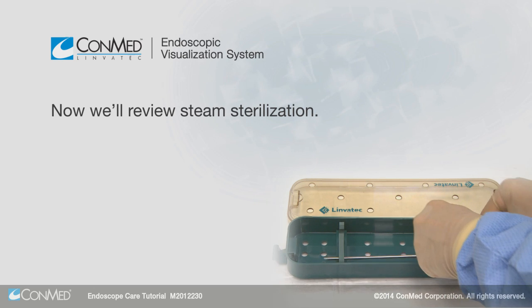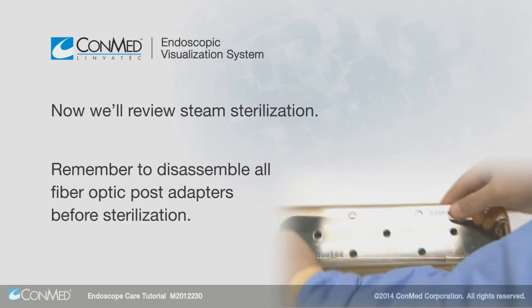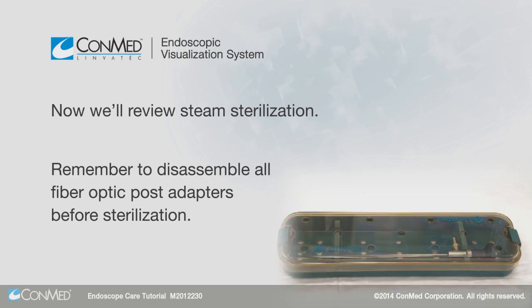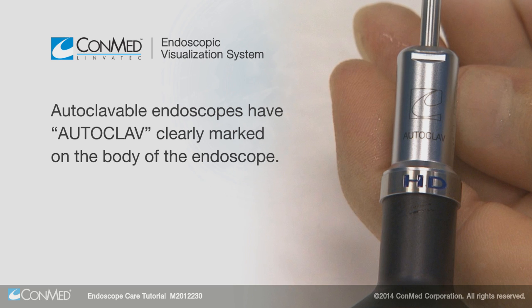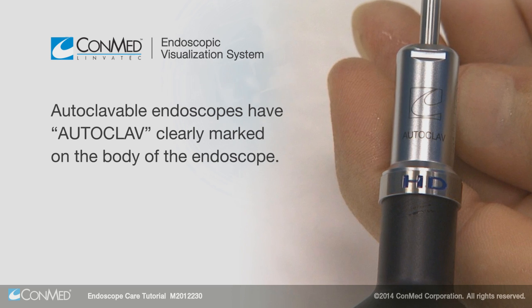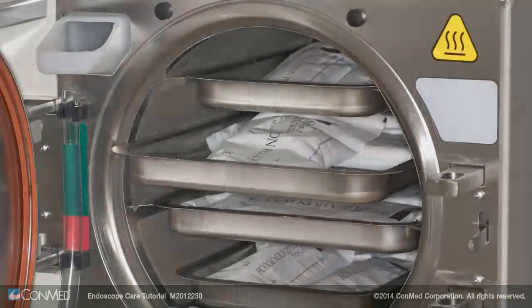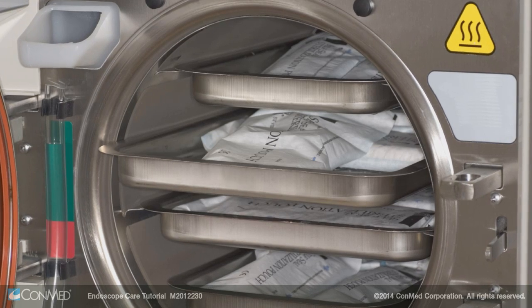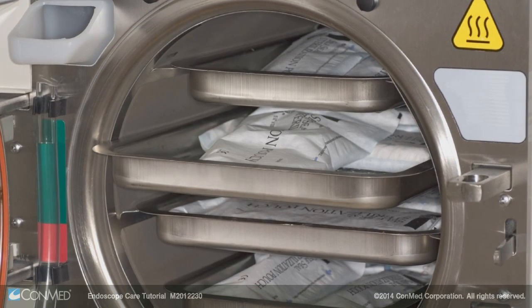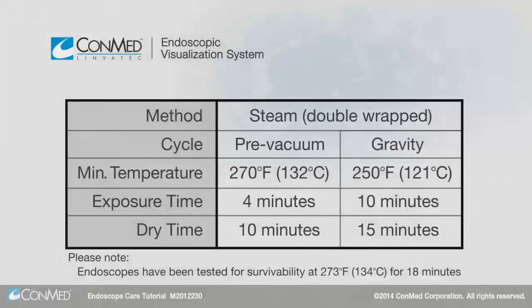Now we'll review steam sterilization. Remember to disassemble all fiber optic post adapters before sterilization. Autoclavable endoscopes have autoclave clearly marked on the body of the endoscope. Only endoscopes with this marking are suitable for steam sterilization. After cleaning, double-wrap instruments using FDA-cleared sterilization wrap, prepare the endoscope so that all surfaces have direct contact with steam, then sterilize using the following parameters.